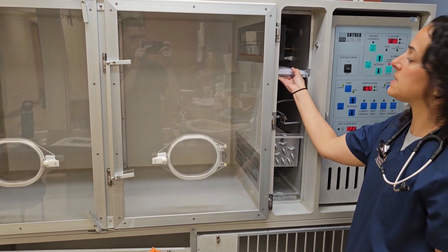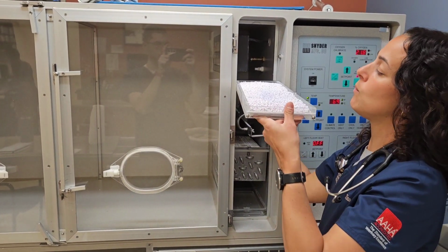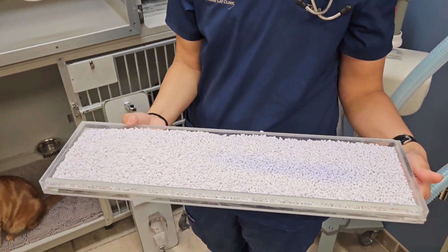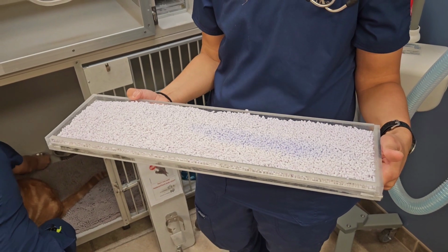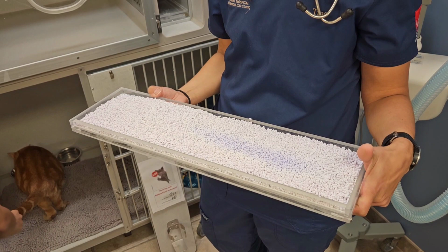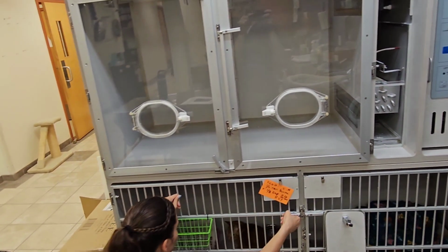So the soda lime is here, and we want to change this every time we are putting a patient in there. You can see that it's a little bit purple. That means that it is spent. So this is meant to absorb CO2 so our patients aren't rebreathing CO2. So when it's purple, it can't be used anymore. We want it to be white. So I'm changing it anyway. I'm just going to dump it in the garbage, all of it.